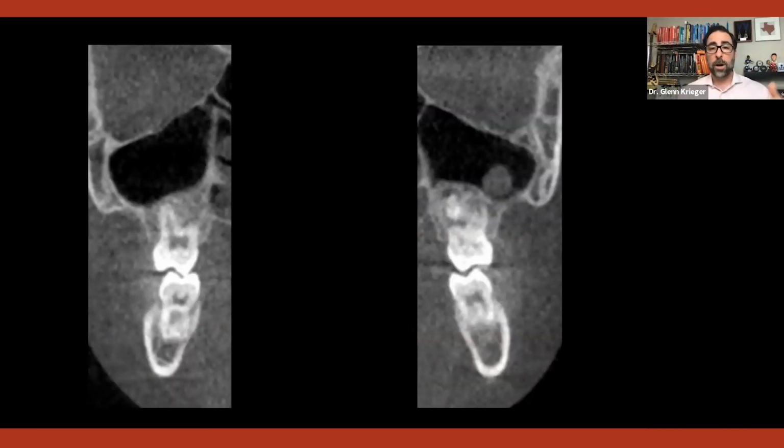So again, this young man that you just looked at, right? To keep it easy, there you can see what was in his sinuses. But look at the inclination of the lower teeth. Look at where the bone is on the ridge of the lower teeth relative to the upper ridge. So I could see this child in my office and say, oh, this is a kid, I'm just going to put some braces on him. And that's that.